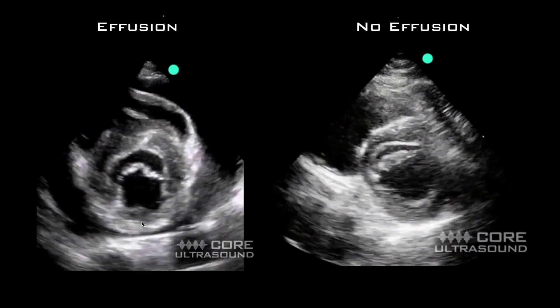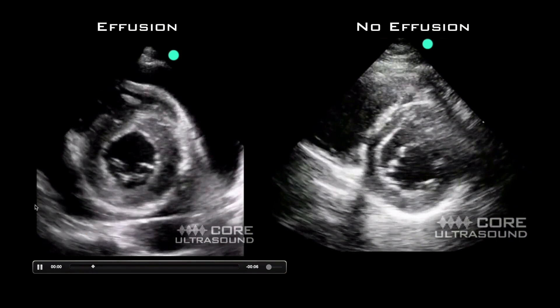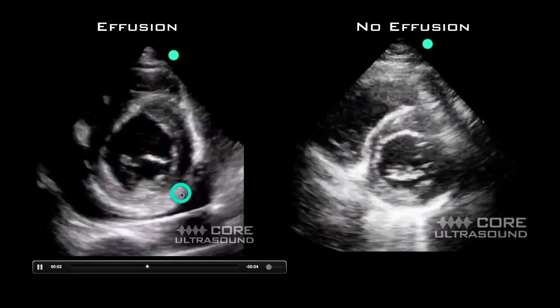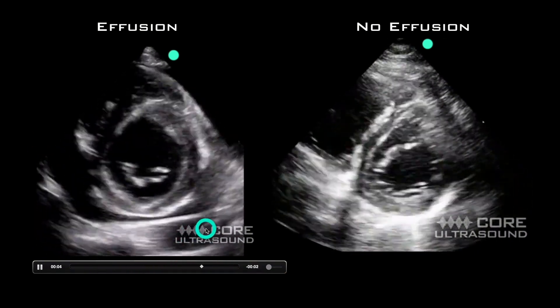This is a parasternal short axis view. You can see fluid all the way around the heart here, and there's the descending aorta.